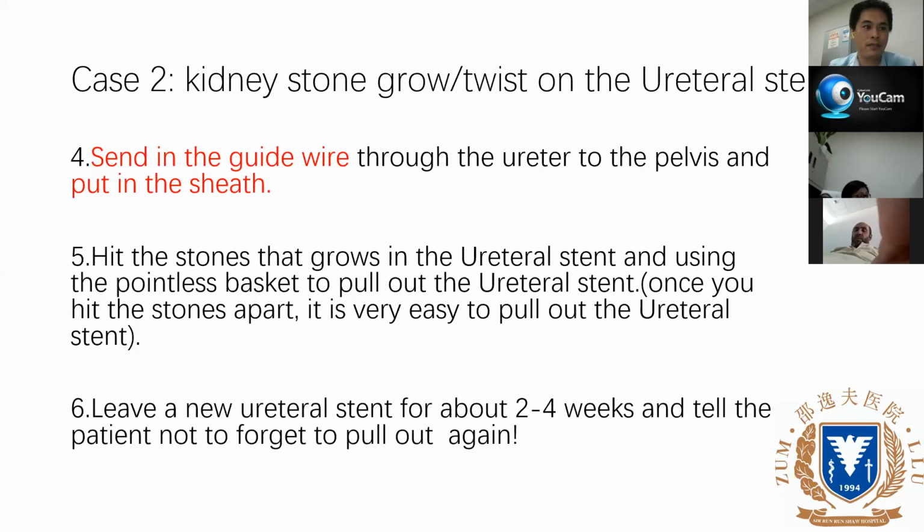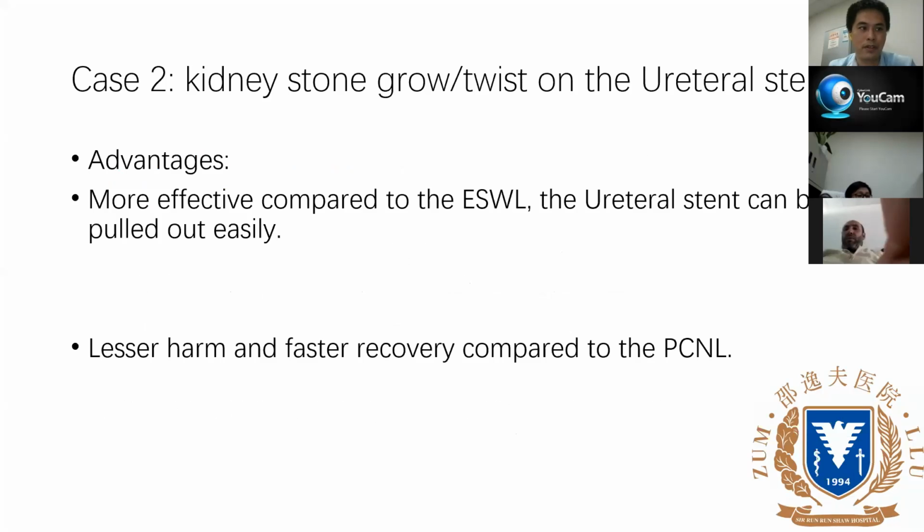The advantage of this method is that it's more effective compared to the ESWL, and it's less harmful and has faster recovery compared to the PCNL.